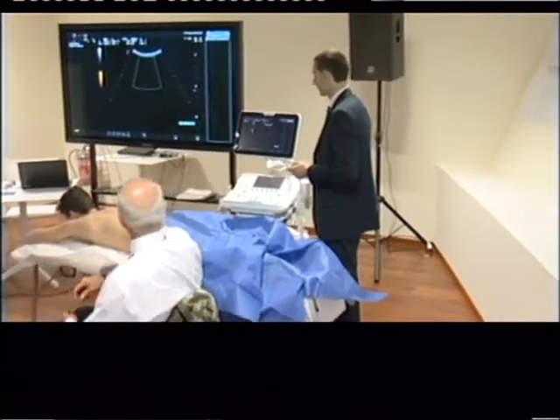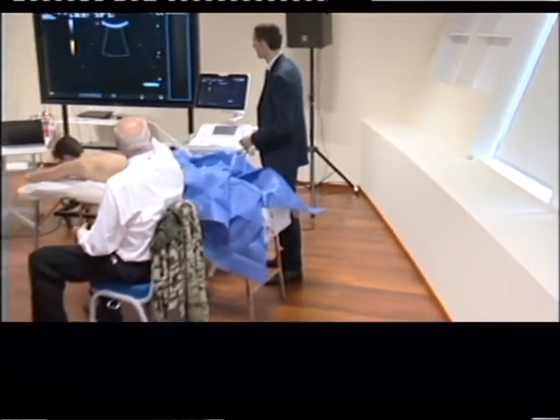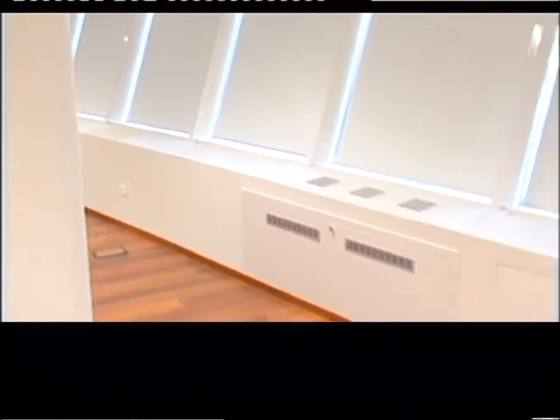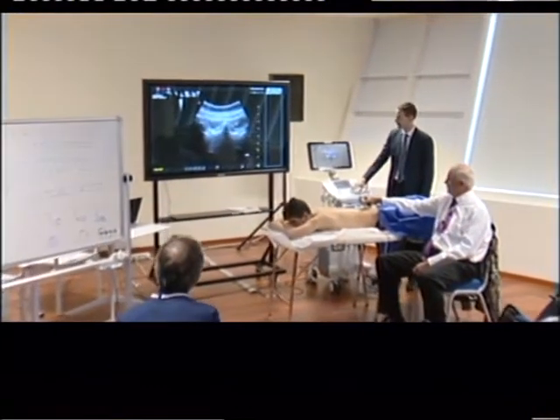Molto meglio. Okay, turn the Doppler off. Doppler off. Okay, so we're a little less depth. All right, there we go. Let's start there. So you can freeze.